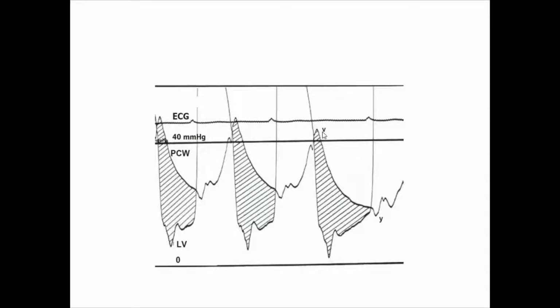And it has a meaning. So now the ECG going with the absence of A wave, this is atrial fibrillation, confirmed. In the pulmonary capillary wedge pressure, there is a prominent V wave, almost 40 or more than 40, for example, 50.